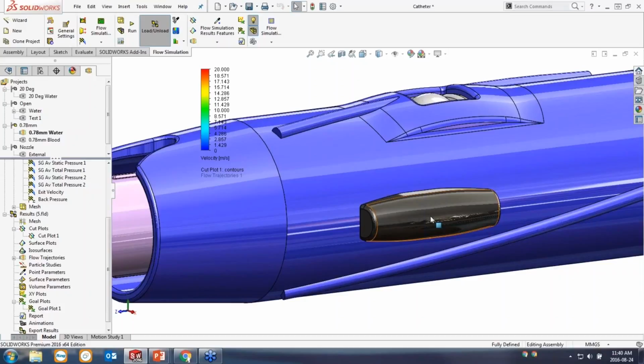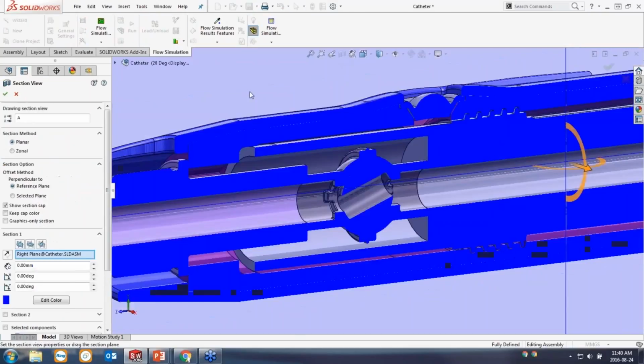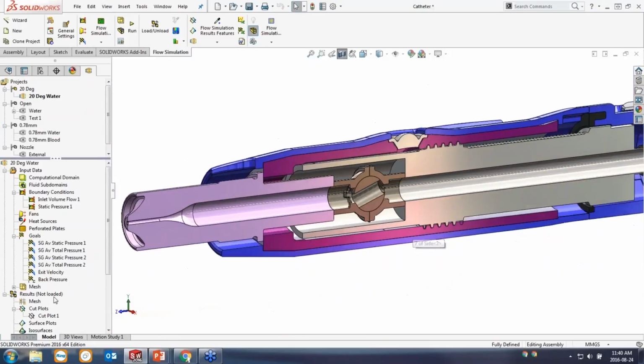Are we going to get turbulence? And so I've created another configuration here where the user has taken that handle and twisted it 20 degrees. Of course, this is going to create a constriction that the fluid is going to have to flow through. It's going to have to bend around it. Luckily, I don't have to set up my analysis again. I just copy that over and I rerun the study.